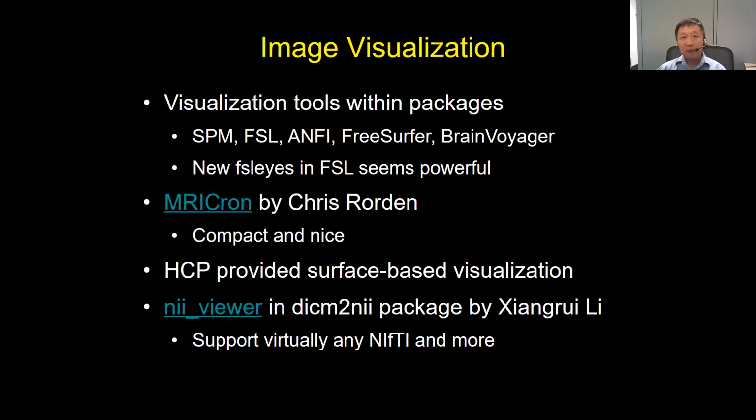Anyway, in any of the major analysis packages, image visualization is very important. You don't have to visualize every single subject and every single run, but at least for a testing run for a participant, at the very beginning when we develop the pipeline, it's very important to visualize each step and make sure everything works fine before we submit to a cluster to run overnight. We don't want to run it for 3 days and find out everything's wrong. So visualization is a very important tool to avoid unexpected problems.